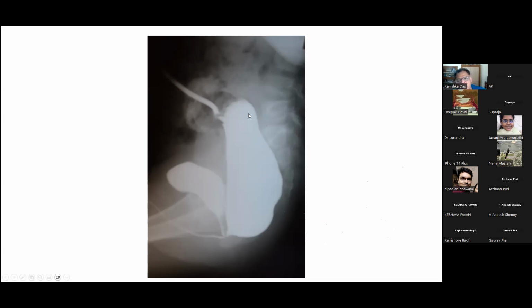So you tell me. I will tell you one thing, that I think this tube has gone a little too much inside. This Foley's bulb is inside, and I really don't know how much more proximal bowel is there, because here this is only a sacral hollow thing. And I cannot see a big fecaloma there, but if it is overfilled, maybe the fecaloma is hiding. So I would need to see more films. So much I will say. Now you tell me more than this.